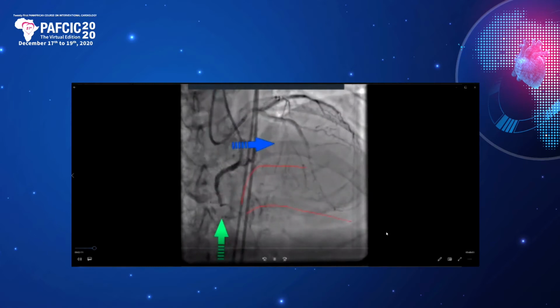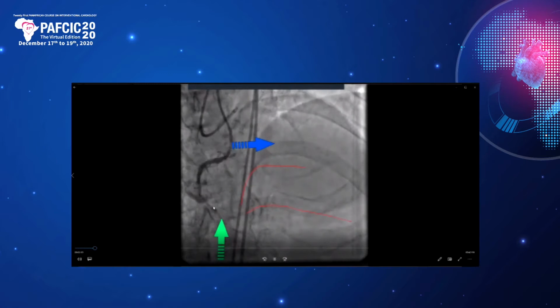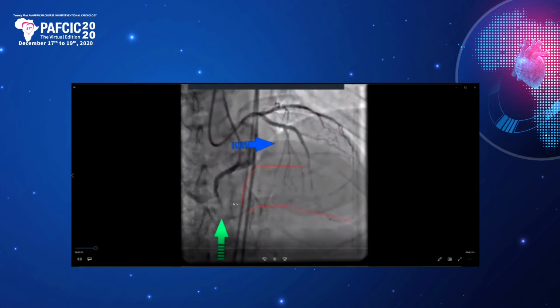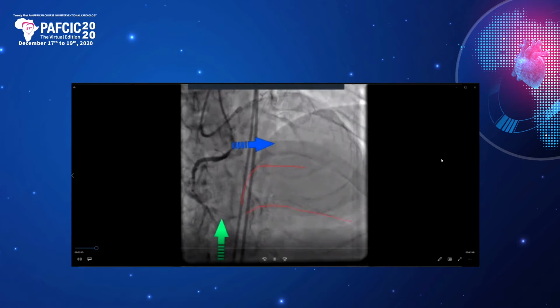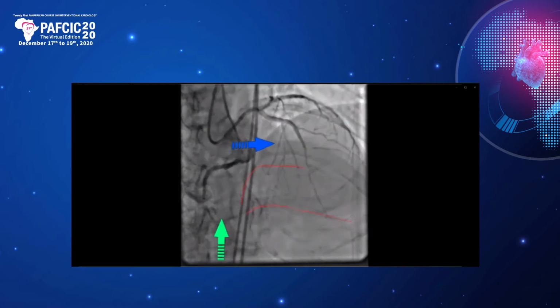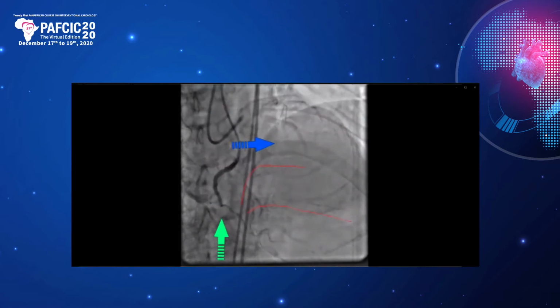If we look at the proximal cap, as we said, there's a blunt ambiguous cap, and distally we need to save the bifurcation, which is diffusely diseased, and we have good collaterals that we can go retrograde. So ideally, this is primarily a retrograde case, where we will go retrograde and then try and join the two, doing the reverse CART.